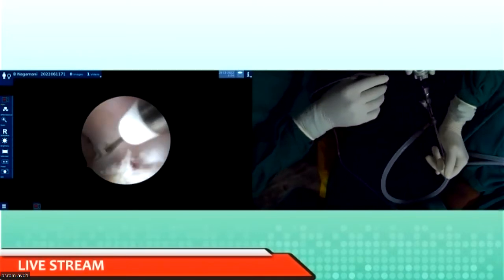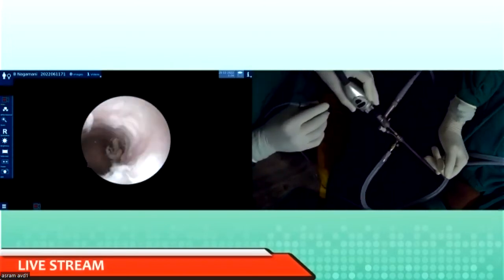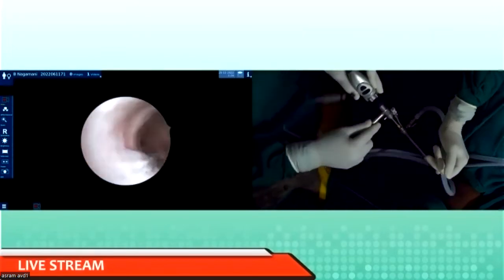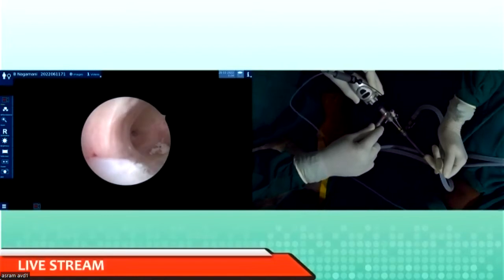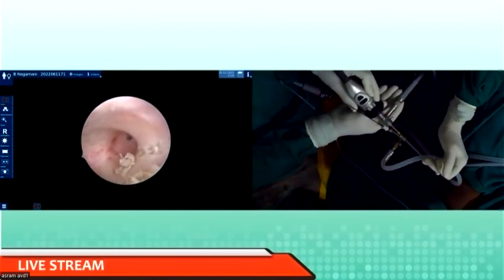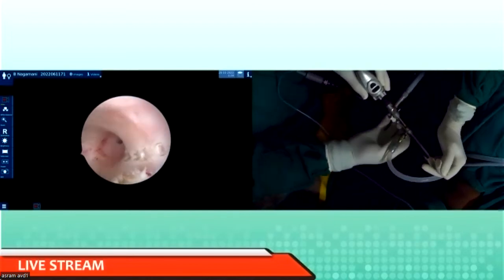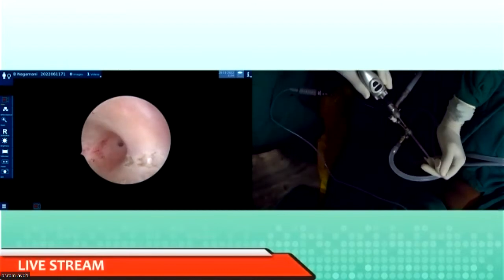You go on doing that. Look at that. You see that you leave behind at least 8 millimeters of myometrium. See, look at that. Now this ostium is seen, right? But this ostium is not seen. So you cut it in such a way that you see these things together. This is also pink. Now if I stop this, it will bleed. Okay, now I have shut down the flow.